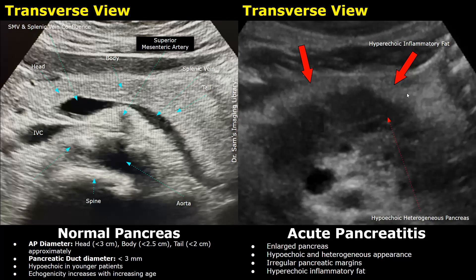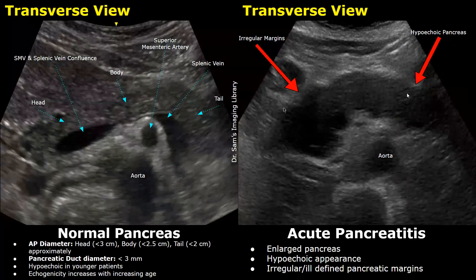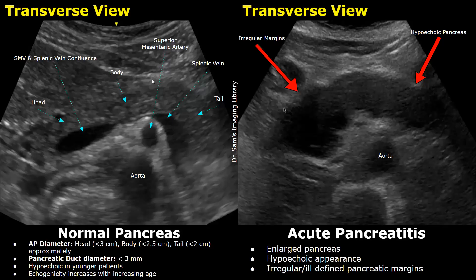This is another case of acute pancreatitis. You can see an enlarged pancreas with irregular margins. The gland is more hypoechoic. The pancreas has an anterior bowing, which is not present in a normal pancreas — this anterior bowing is another feature seen in acute pancreatitis.